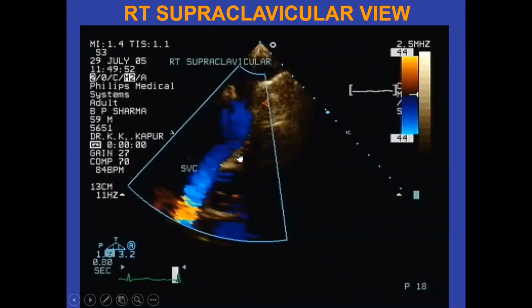There are a lot of questions, but for the paucity of time, I'll take 2 more questions, which are repeated by a lot of participants, about the Crab view, and specifically the Crab view with respect to the pulmonic view.